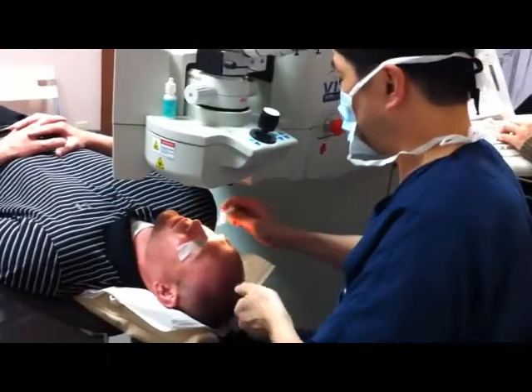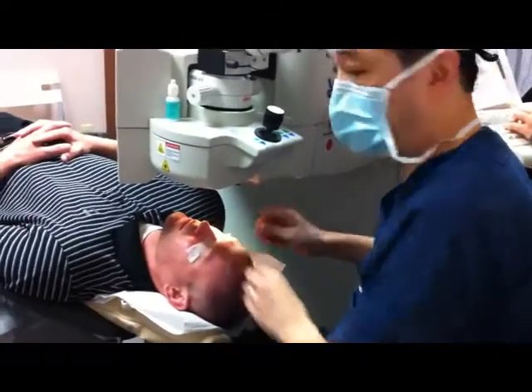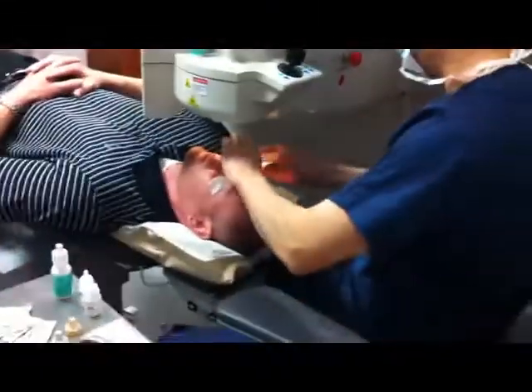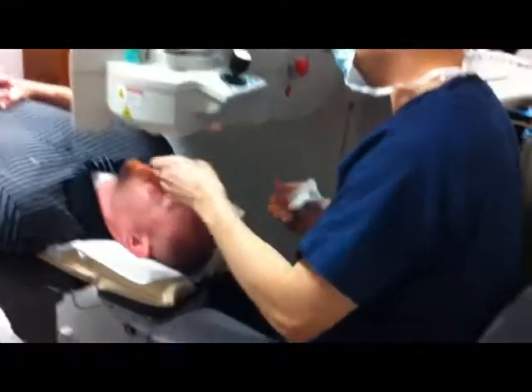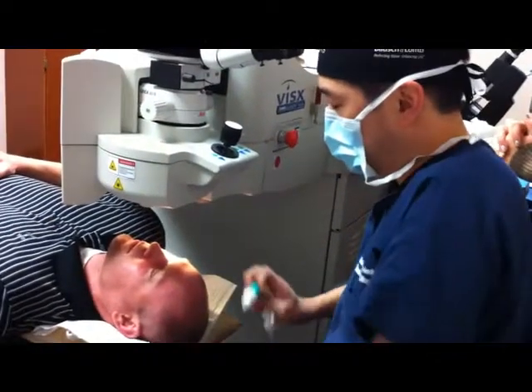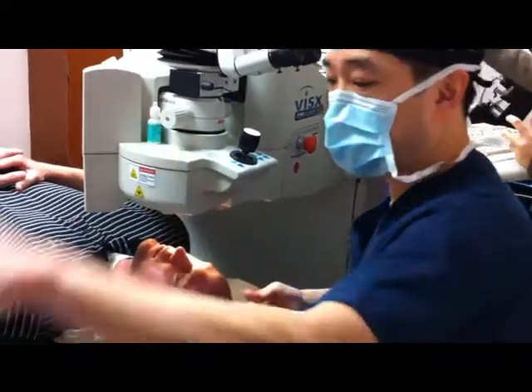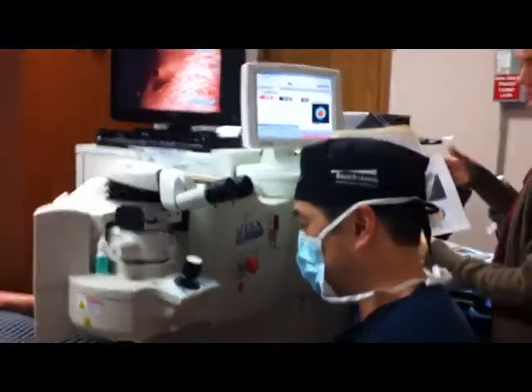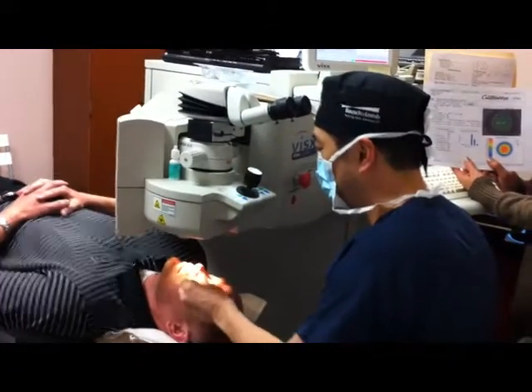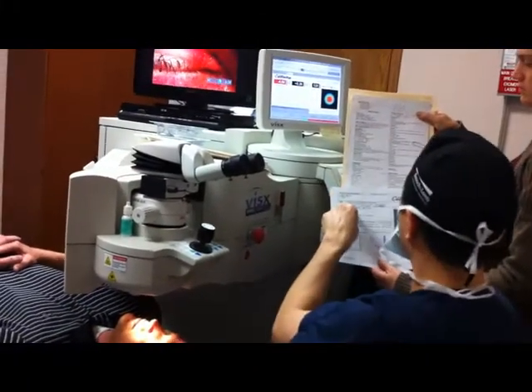I'm going to add a few little drops here to your right eye. Close your eyes softly. Take this away. I'm going to patch your right eye. Numb your left eye. Blink a little bit. Verify treatment, please. Close gently. One eye, your right eye went perfectly.